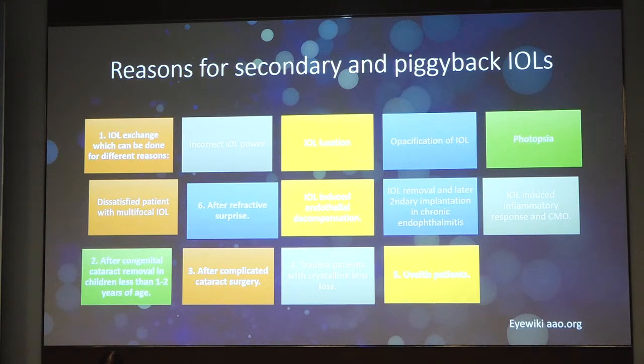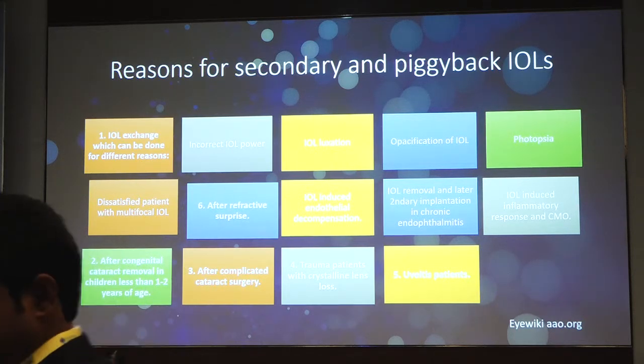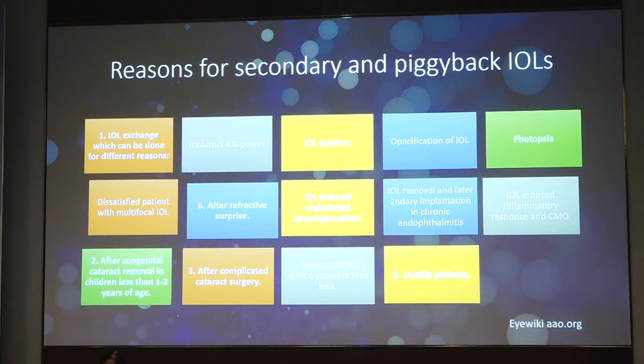Tell the patient that half the surgery has been done, the cataract has been removed. We'll put the lens in later, wait for the cornea to clear, wait for the eye to settle, and do it anywhere 3 or 5 days later. So don't rush with your secondary IOL, and he gets very good results. So this is a take-home point: tell the patient half the surgery is over, and you'll do the remaining half when the eye clears up a bit.